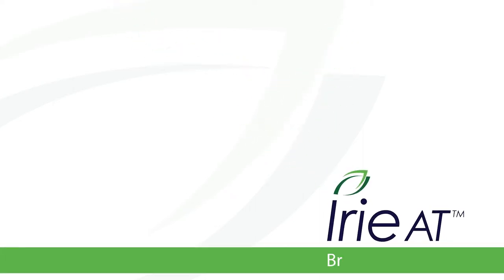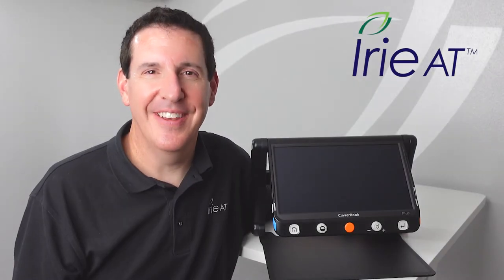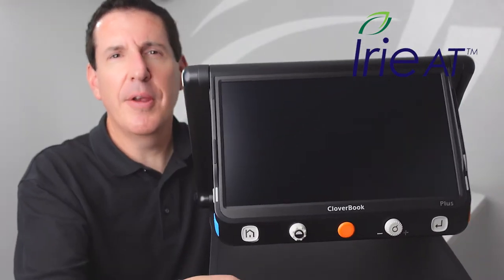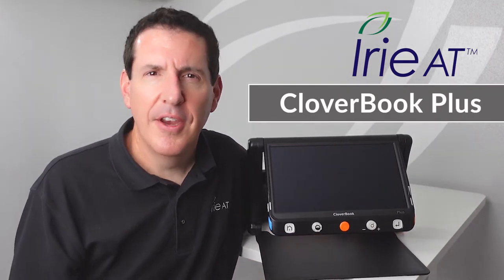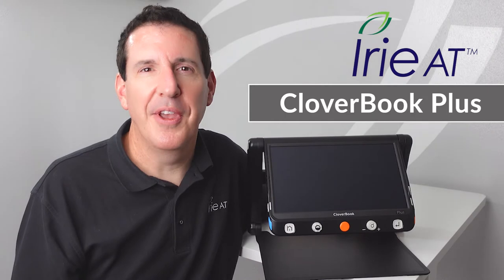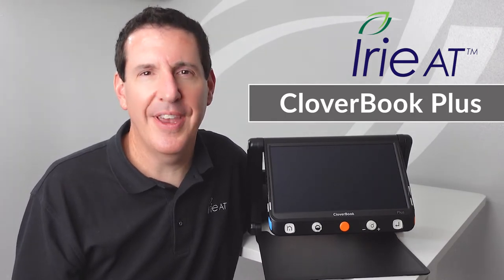Welcome to IvoryAT Braille and Low Vision. Thanks for joining us in the IvoryAT Product Review Center. Today we're going to be taking a look at the CloverBook Plus — another great magnifier from SiteCare, another of the CloverBook series. If you're thinking about getting one or you already have one and want to learn how to use it better, this video is hopefully going to be helpful. Let's take a deep dive into the CloverBook Plus from SiteCare.